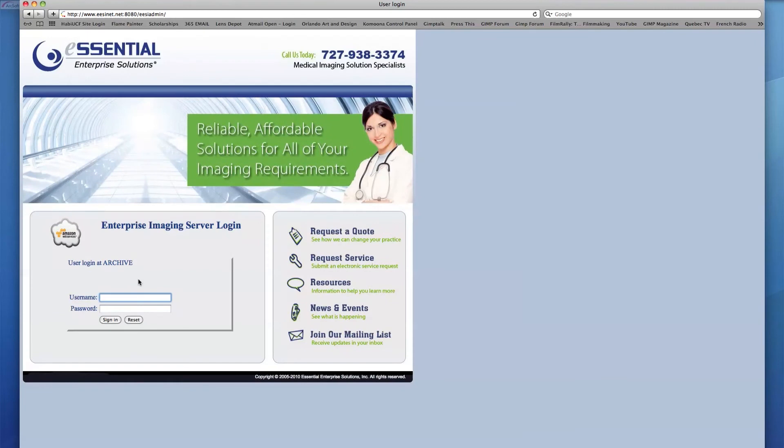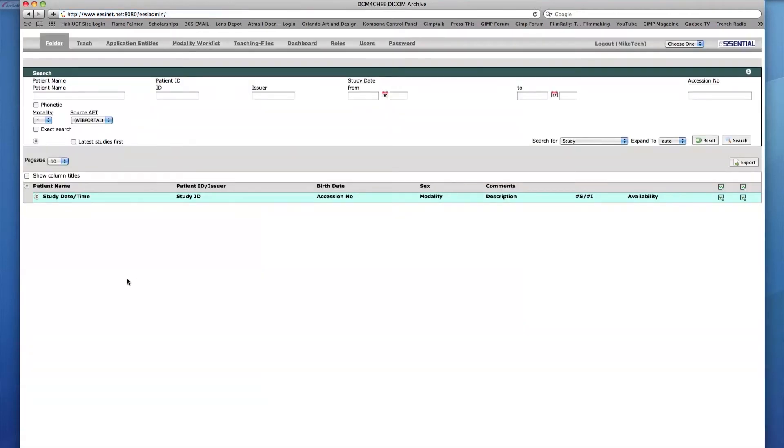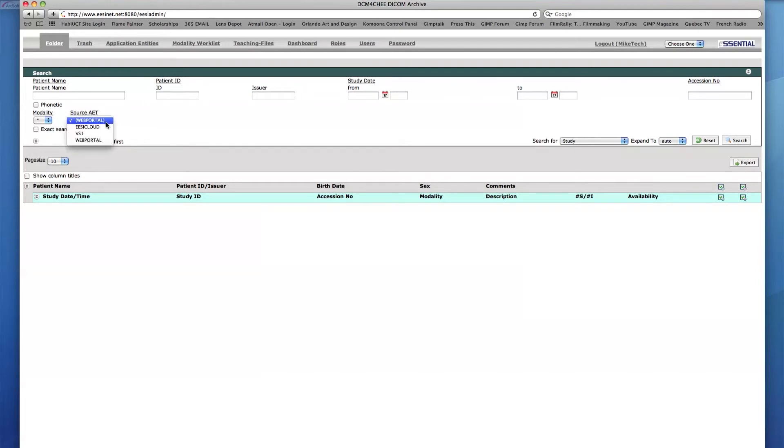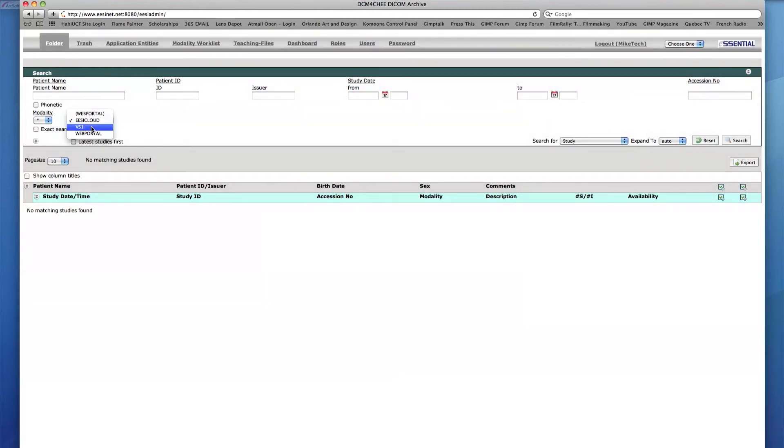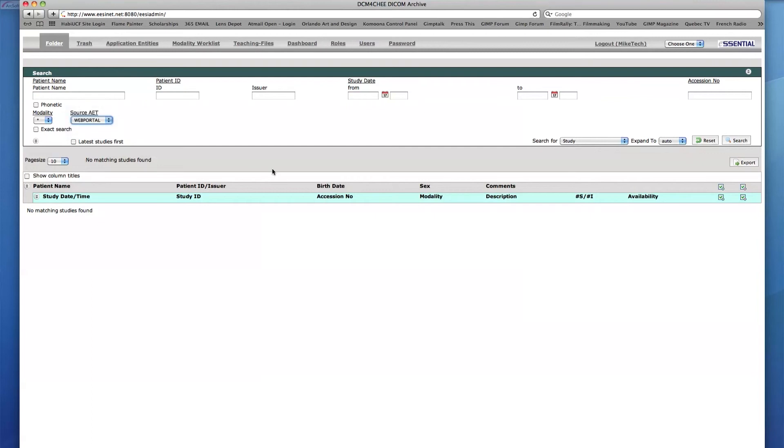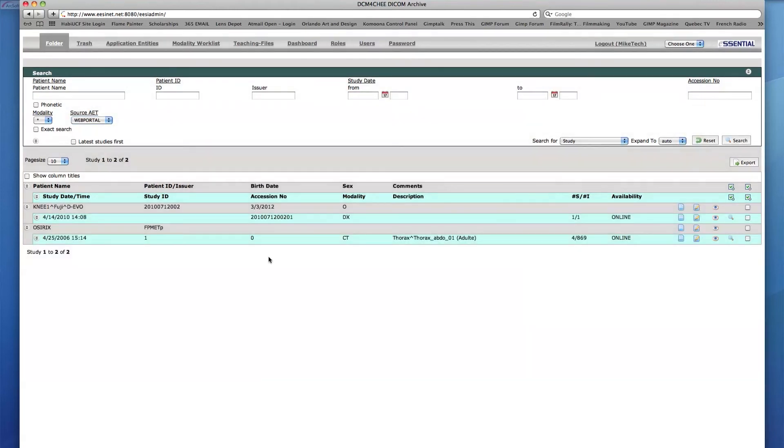I'll log in with the newly created Mike Tech user to demonstrate the restrictions of this user. For starters, in the Folder tab you'll notice that a set of three icons is missing that include New Patient, Delete, and Move. This is because we've placed a restriction on this user that disallows any of these tasks to be performed on these studies in the archive. The next limitation appears when we attempt to view studies from any other application entity besides Web Portal, which is the only application entity we allotted this user access to.